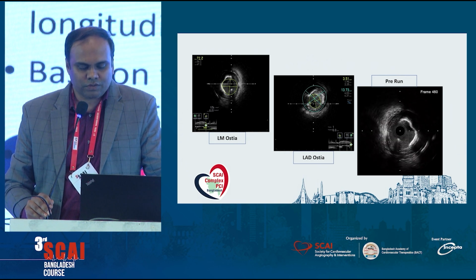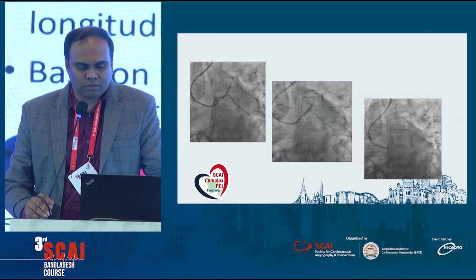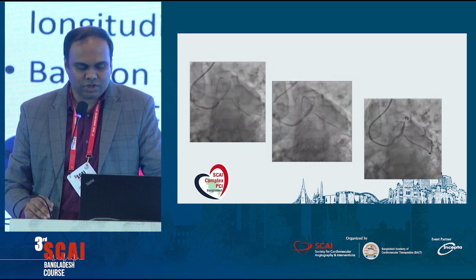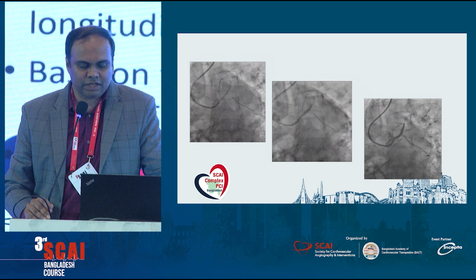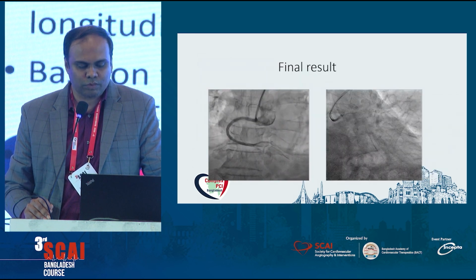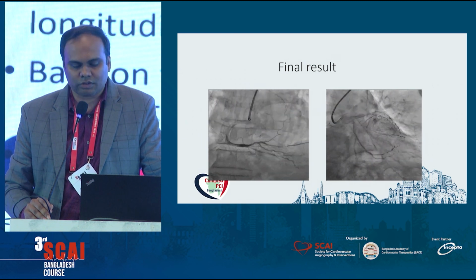Based on the imaging information, the technology for lesion preparation is selected, and a high degree of severe calcific lesion requires more aggressive lesion preparation with rotational atherectomy, IVL, or orbital atherectomy.